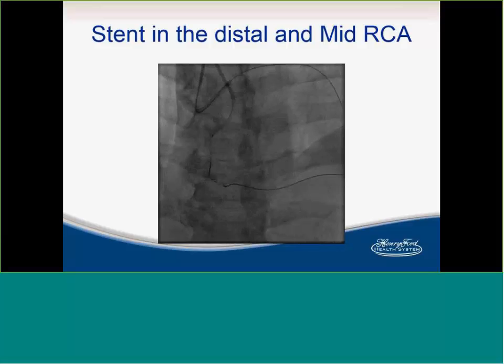No, I agree with you. I think you can just try first to push, and actually even for septal, sometimes you're twisting. I had several cases where you just try gently pushing it, and it takes its time and finally comes through by itself. So exactly. You don't necessarily have to go crazy about it.